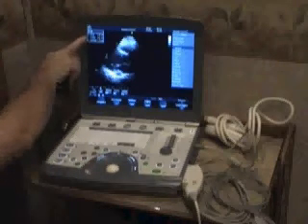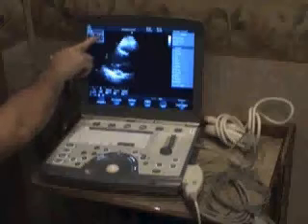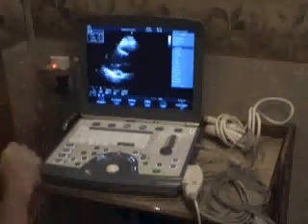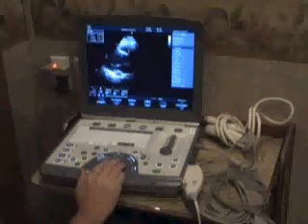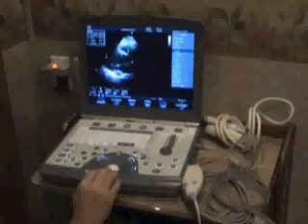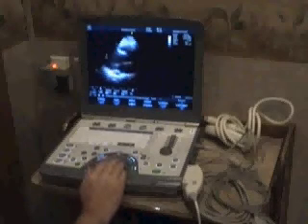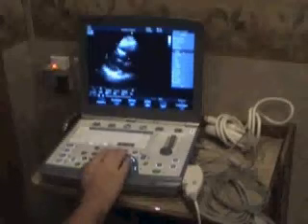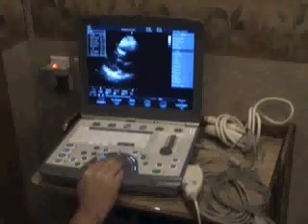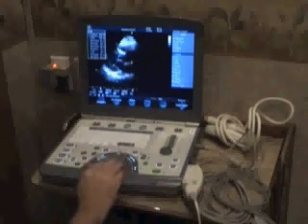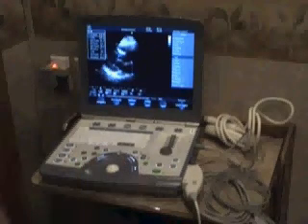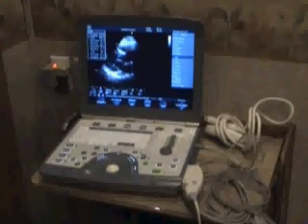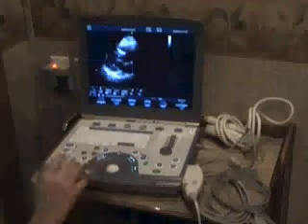Those measurements are taken from the ventricular septal wall to the end of the ventricular septal wall, down to the beginning of the posterior wall, and down to the end of the posterior wall. I have measurements for the intraventricular septum at 1.4, the LVID — left ventricle internal dimension — at 4.6 centimeters, and the posterior wall at 1.3 centimeters. We are also going to measure the beginning of the aortic root from side to side and store it. We'll take it to end systole, when the heart is squeezed as tight as it will, and also take a measurement of the LA or left atrium. In my case, I have an EF or ejection fraction of approximately 71%. Anywhere from 60 to 75 is considered normal, and we'll go back to 2D.